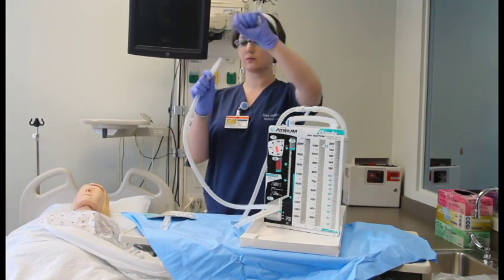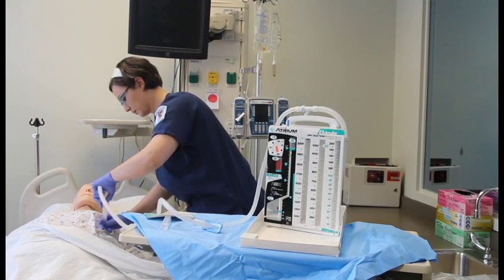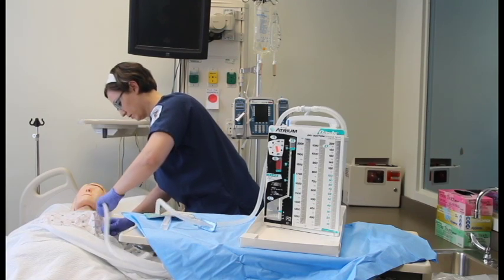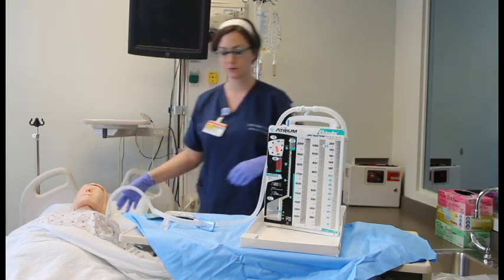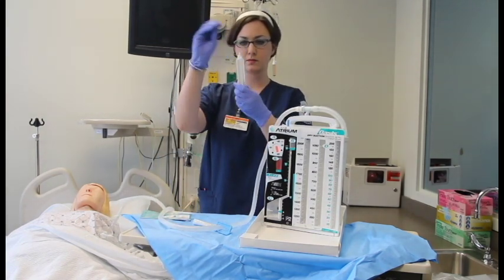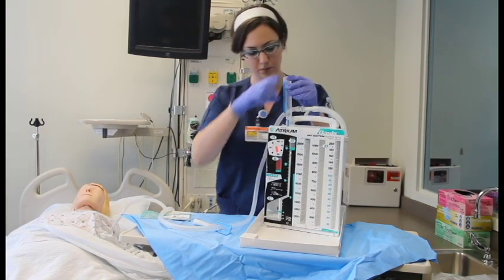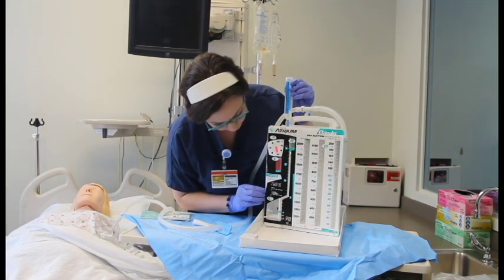Take the cap off the connector end of the collection tube and connect it to the patient's chest tube. Inject sterile water into the water seal chamber through the needleless injection site on the top of the unit. Fill to the 2 cm water seal level.